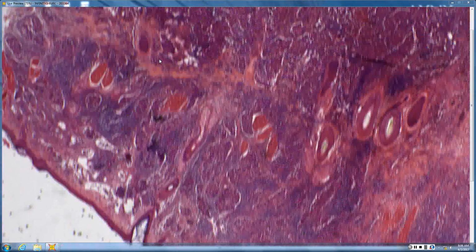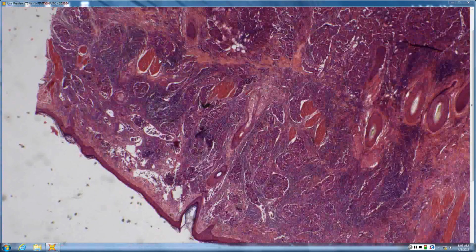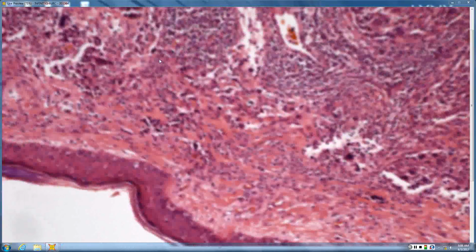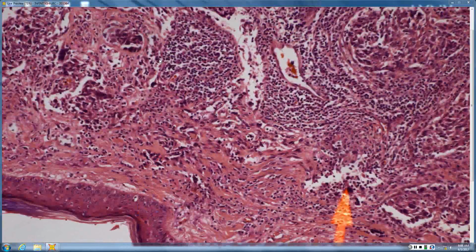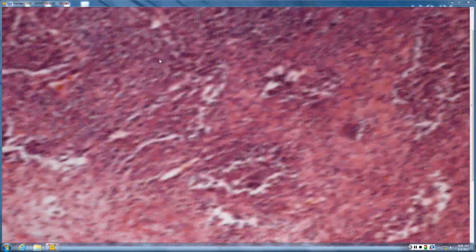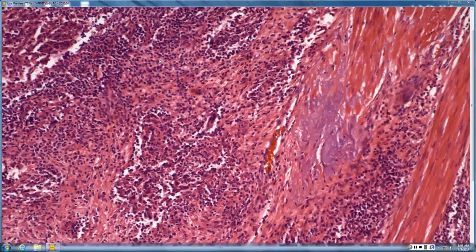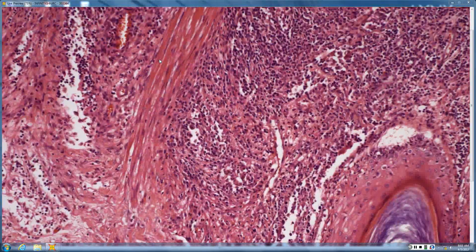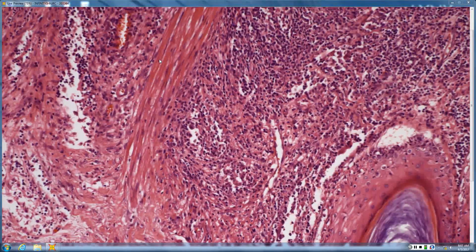Big or small? Very big. And then the question is, okay big or not so good big? Looks like not so good big. And then in the dermis, how would you describe these spaces? Are they well-defined, round, nice shapes? Very ill-defined, jagged. Lots of hyperchromatic, irregular cells. So what are you thinking? Angiosarcoma. So a big epithelioid, ugly angiosarcoma, but still some areas where you can make out those crack-like spaces. Very good.